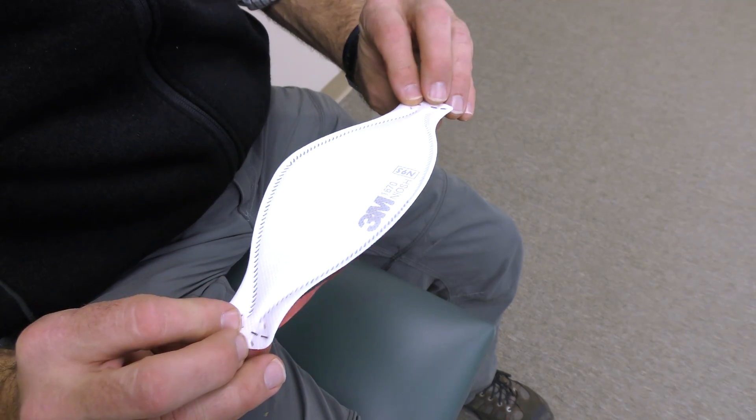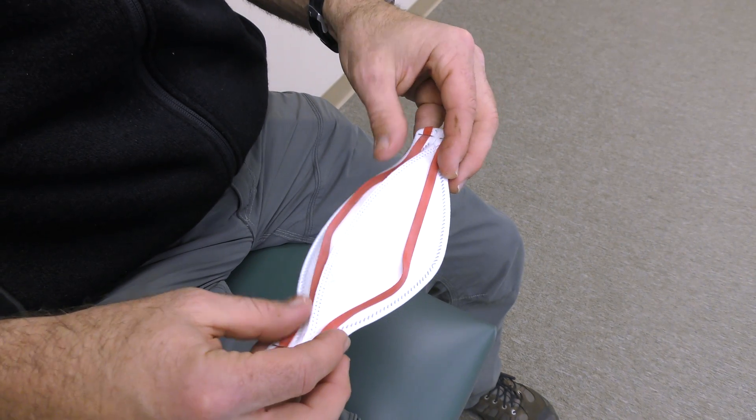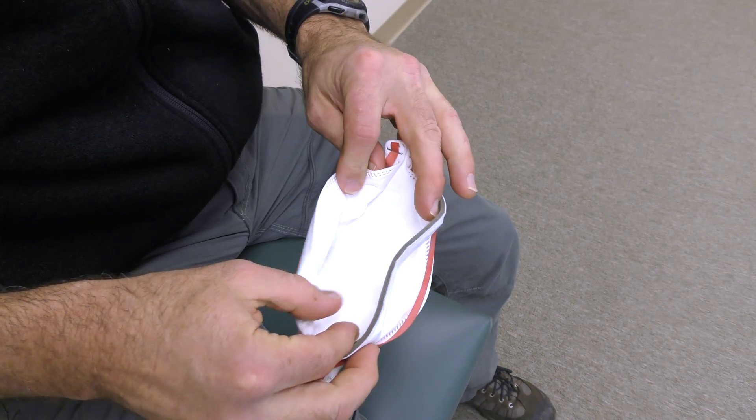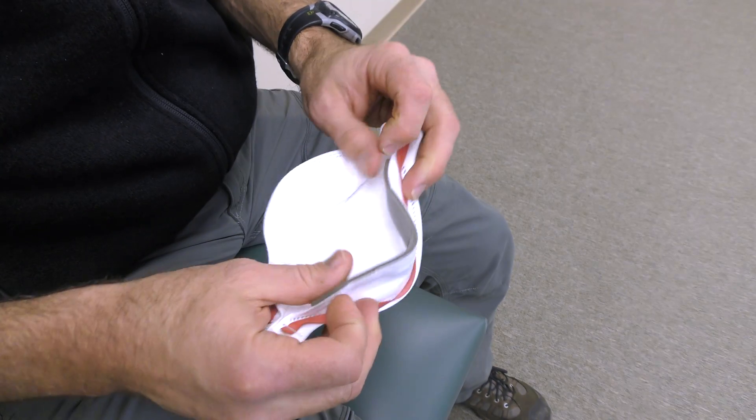First, fully open the top and bottom panels of the mask, bending the nose piece around your finger at the center of the foam. The straps should separate when the panels are open. Make certain the bottom panel is unfolded and completely open.